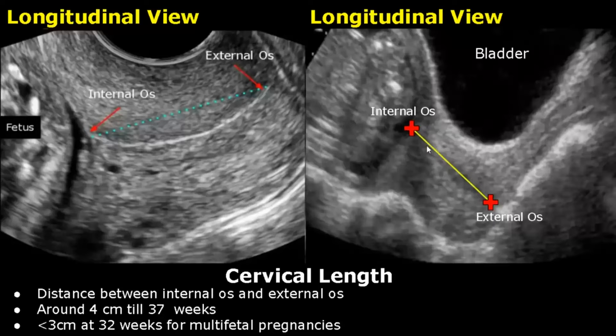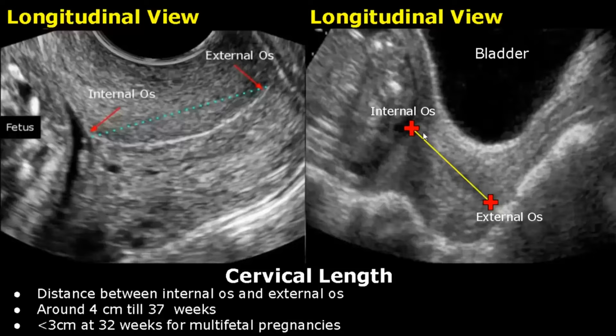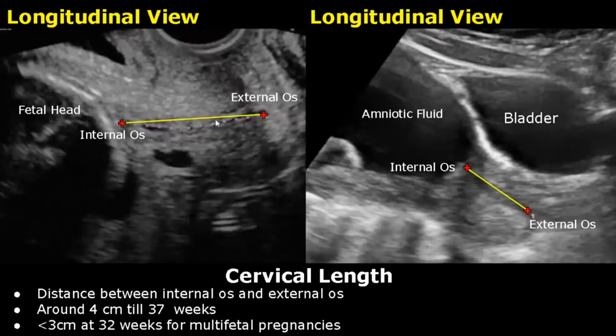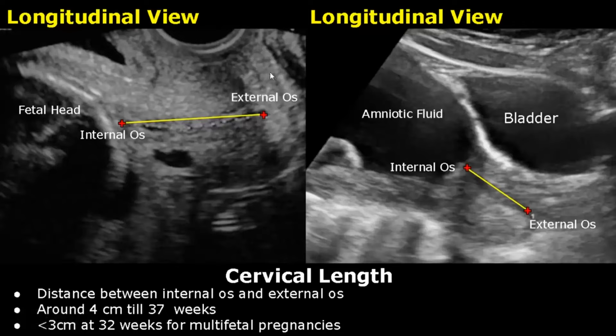Cervical length can also be taken in a transabdominal view, but it is not as accurate because a full bladder often leads to an increased value. This is the internal os where one caliper is placed, and this is the external os where the other caliper is placed. Here are more images showing measurement of cervical length in transvaginal and transabdominal approaches, with the bladder and amniotic fluid visible.